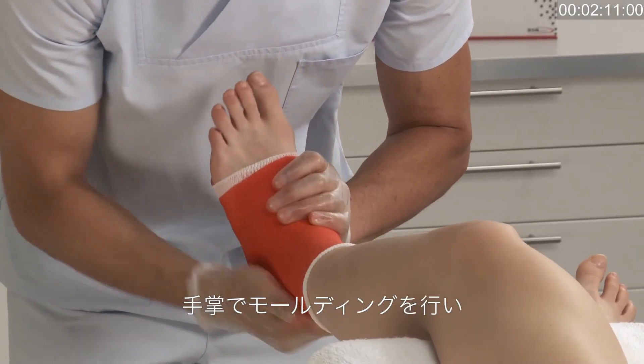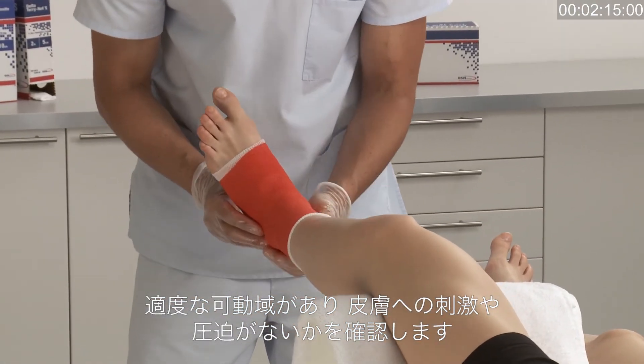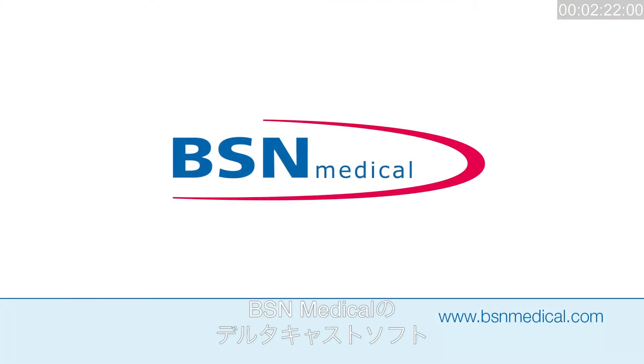Fix these cuff ends with a second layer of cast tape applied as before. Mould and smooth down the cast with the palm of your hands, and check the desired range of motion and any points that may cause irritation or pressure points. Deltacast Soft by BSN Medical.